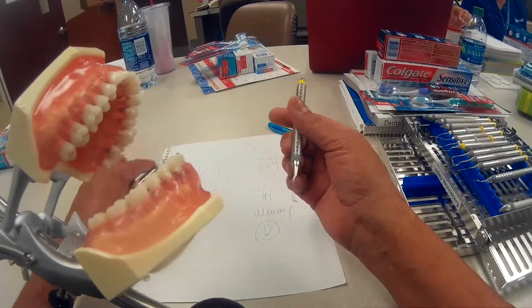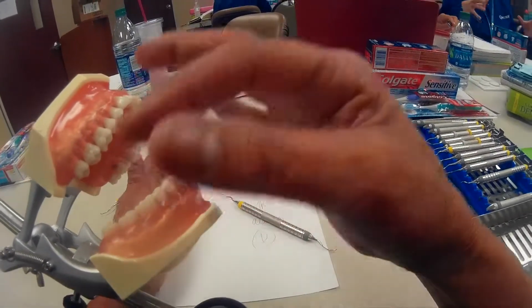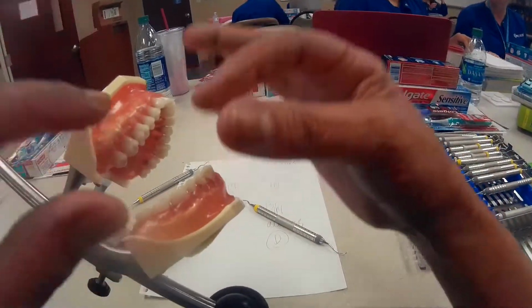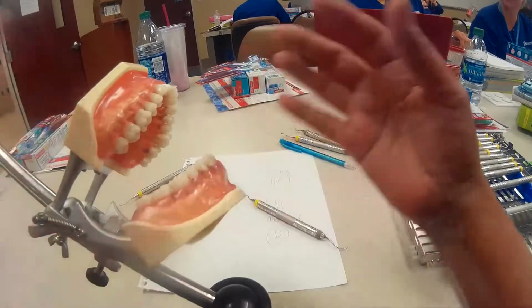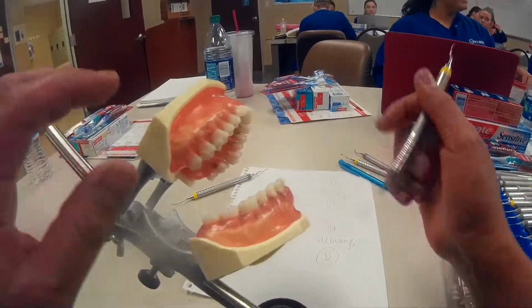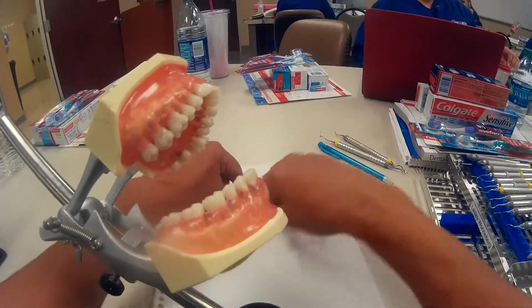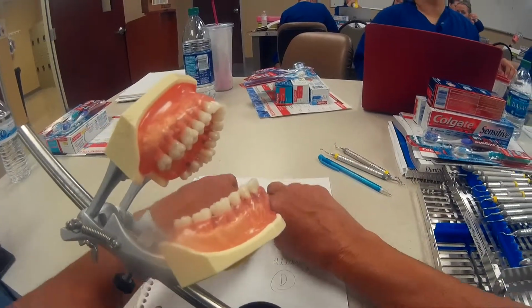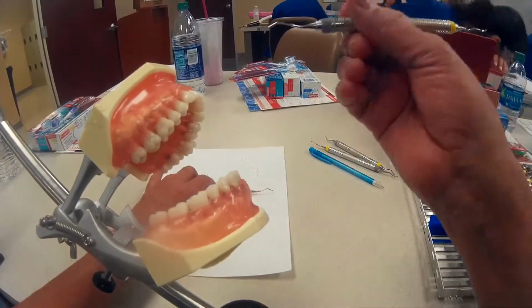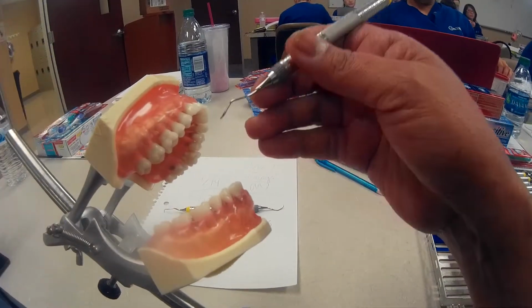And what you need to determine at the very beginning is which sextant you're at. Let's say we're going to go back to, again, this lower right on the typodont, only because it's easier for you guys to see. Then I'm going to pick up one of these two. I don't know which one. I'm going to mix them all up. Here, they're all mixed up. Okay? So I'm going to pick one up. It's supposed to be a joke. And I'm going to start with the distal of number 31.